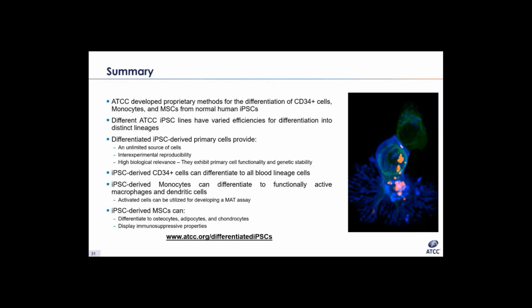Okay, and next question. What is the longevity of the iPSC-derived mesenchymal stem cells? Or, in other words, how many population doubling levels and passages can they go? So this is a good question. They can be proliferated at least 20 population doubling levels, or over 10 passages.